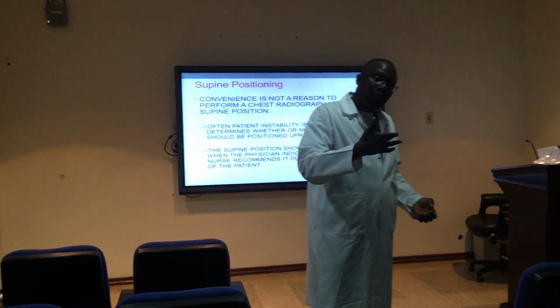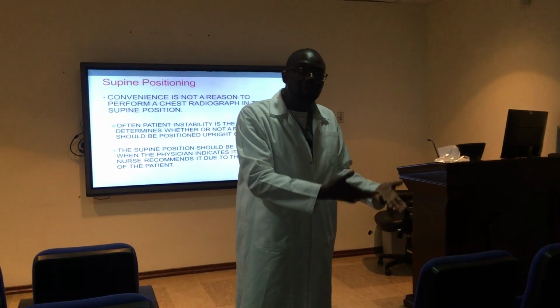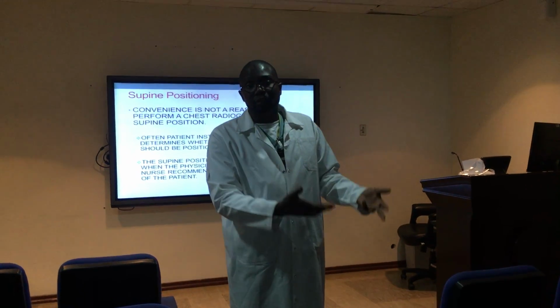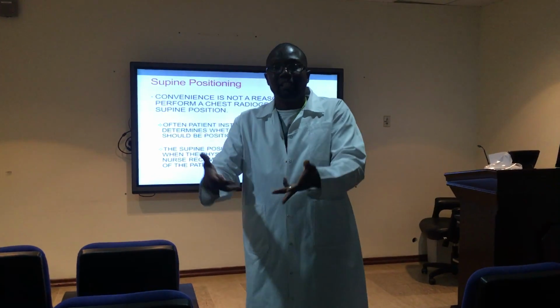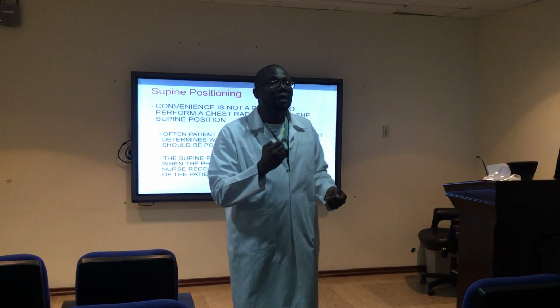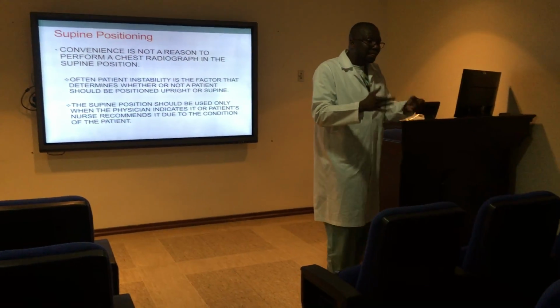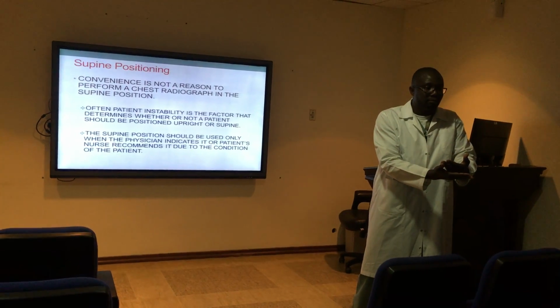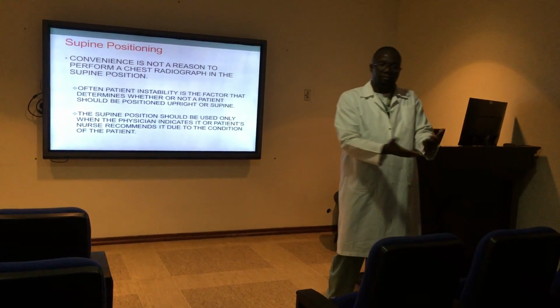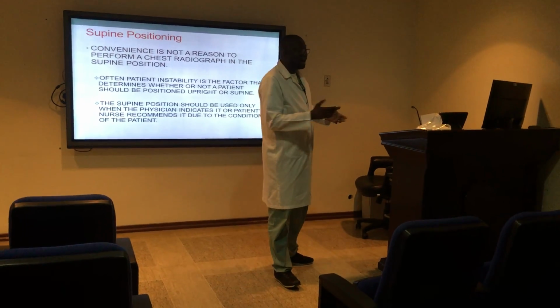But once you get the understanding and cooperation of the nurse before going in there, most of the time the nursing staff will be with you in the room while you are doing the exam. Okay? So if anything happens, at least she can be there to quickly prevent any adversity from happening. Okay?